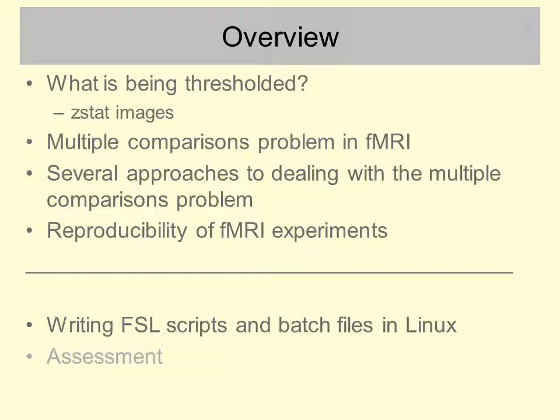In today's workshop, we've got a worksheet on how to write batch files in Linux to call the FSL programs, which can save you an awful lot of time and allow you to do things that you probably wouldn't otherwise think of doing if you were just using the graphical user interface. I'll give you some more information about the assessment. And also you can finish the worksheets from last week and the week before if you didn't finish those.